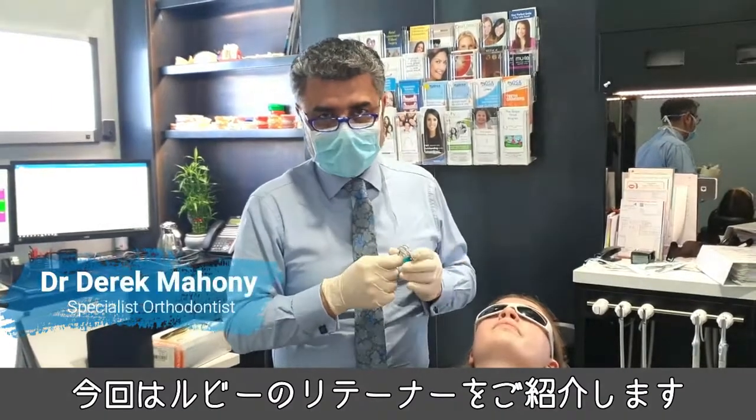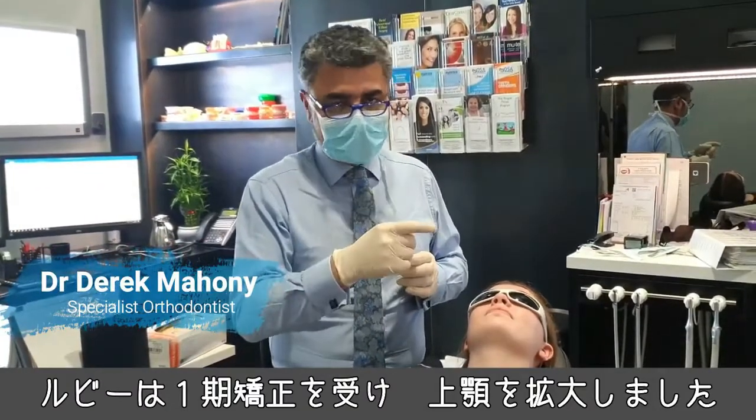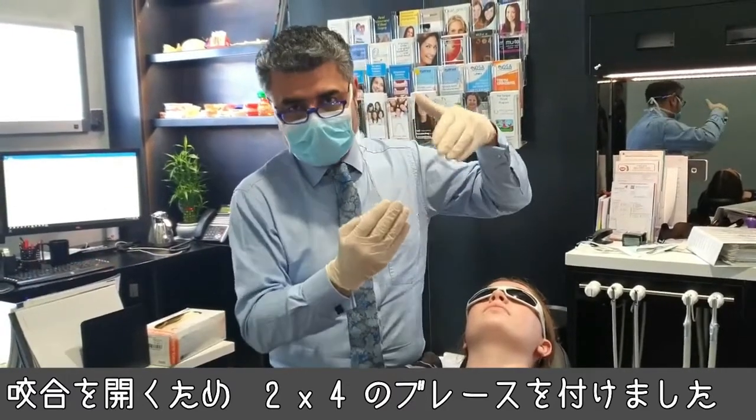I'm doing retainer reviews today. Young Ruby has come in. She's had phase one treatment which involved arch development of the palate and then partial braces — what's called a two by four — to open the bite.